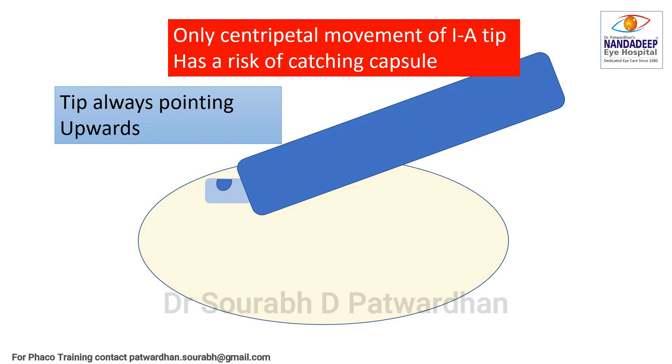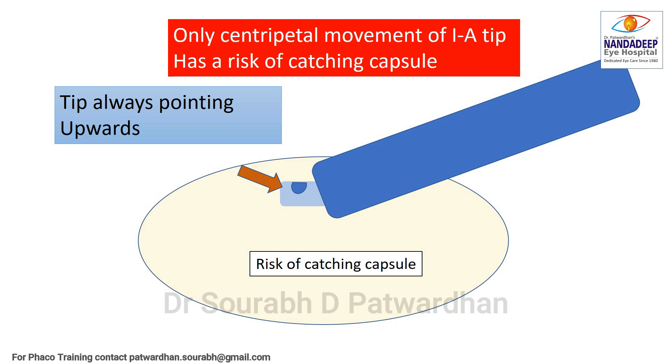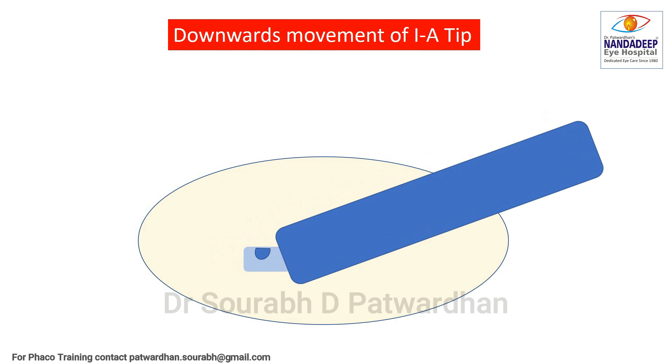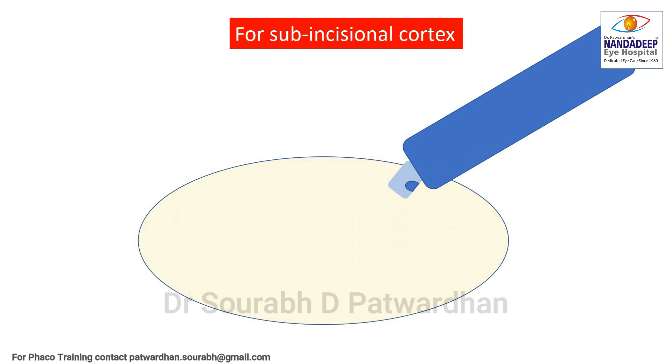We should always use the coaxial IA tip with the opening pointing upwards as far as possible. If we use only the centripetal movement of the IA tip, there is a higher risk of catching the capsule. So instead, what I do is pull the IA tip downward after holding the cortex. This keeps the tip away from the capsule and the fluid wave helps in peeling the cortex away from the capsule, making it quicker and safer.